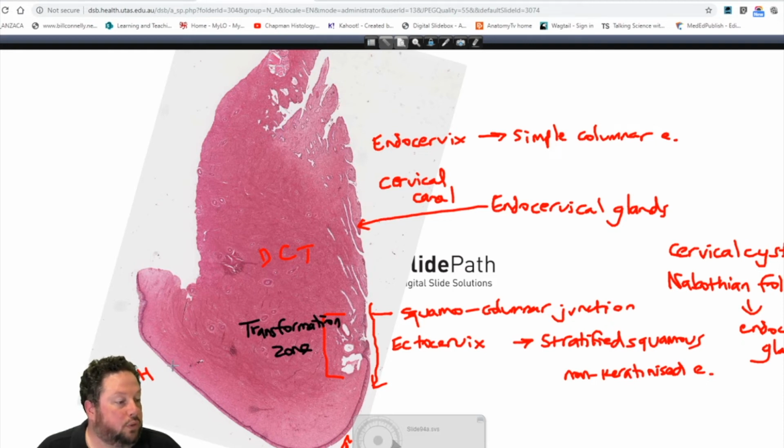Does someone who has not gone through puberty still have an ectocervix? Yeah, they still have an ectocervix, and the ectocervix is always there. It's just that they haven't had this episode that happens during puberty where the endocervix grows out into the external os and then gets that transformation happening. Histologically, it's really interesting. So if you see these follicles or these cysts, these are actually natural. This is part of that process where the endocervix grew out, gets transformed through the acidity, and then those glands get blocked off.